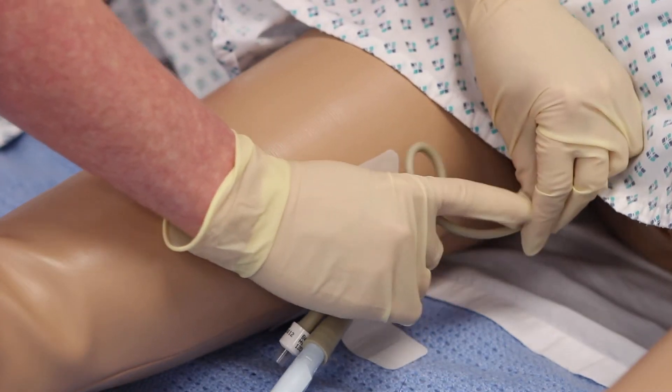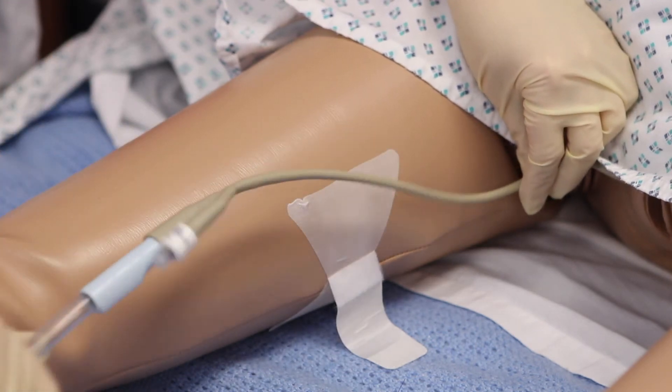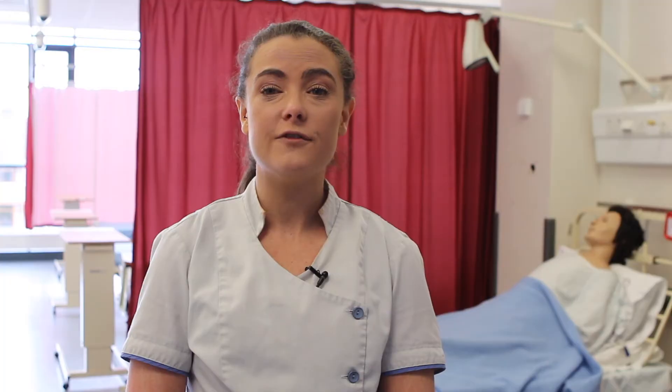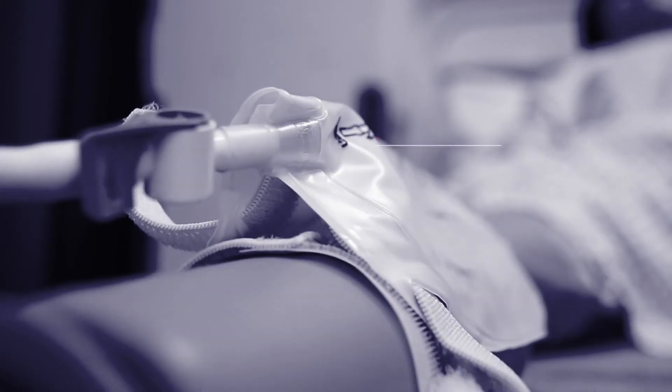If you think your urinary catheter is blocked or bypassing, ensure the catheter tube is not kinked and the drainage bags are below the level of the bladder. Increasing fluid intake may reduce the risk of blockages. Your doctor will be able to advise you on suitable fluid intake.